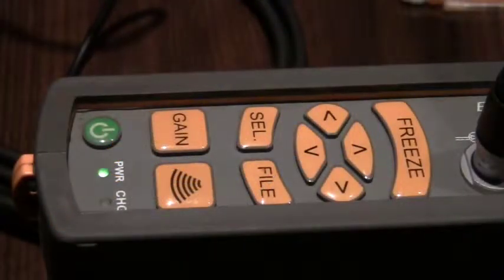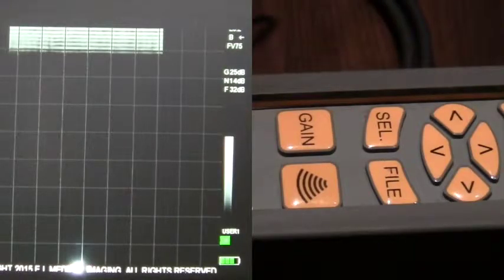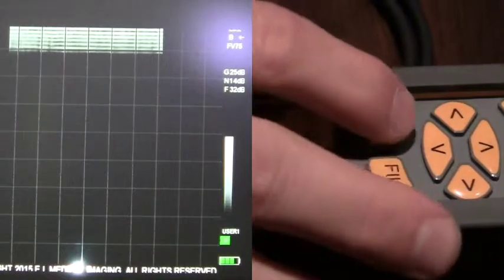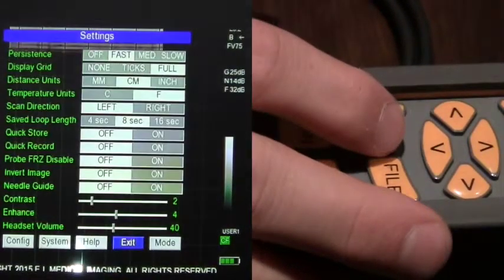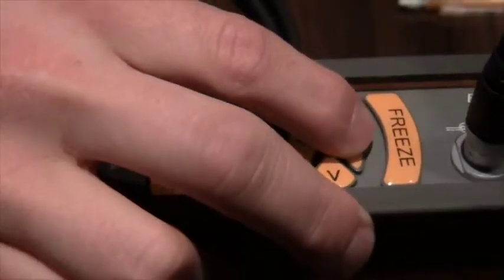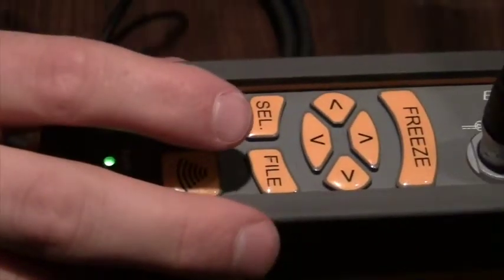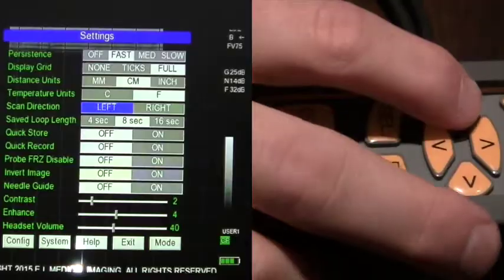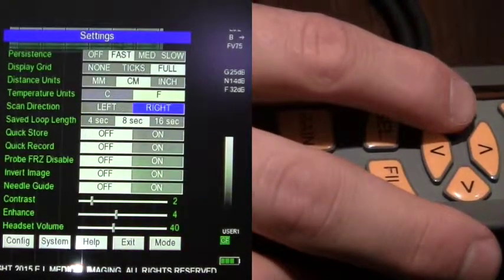To adjust the image direction on the IBEX light, first note the arrow in the upper right-hand corner. Then, by selecting the Select key and using the up arrow, get to the line listed as Scan Direction. Highlight left or right, whichever is preferred. Note the arrow change in the upper right-hand corner.